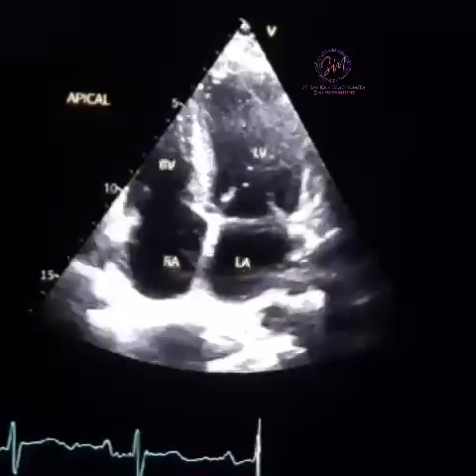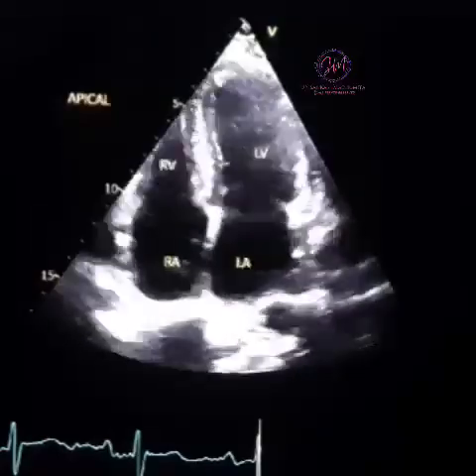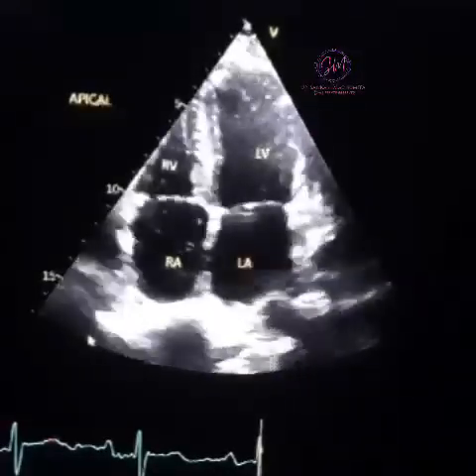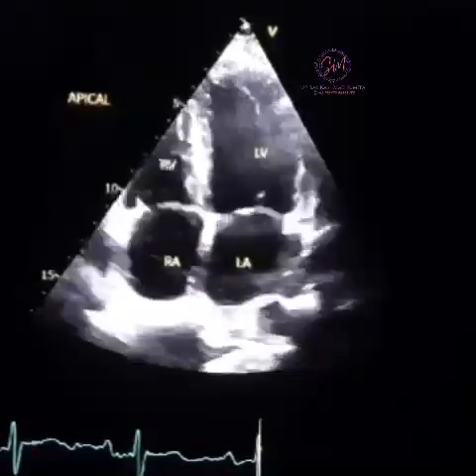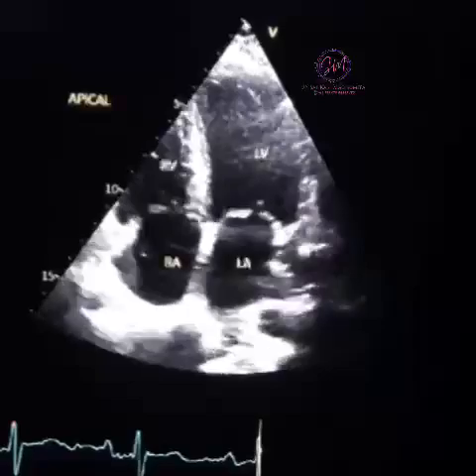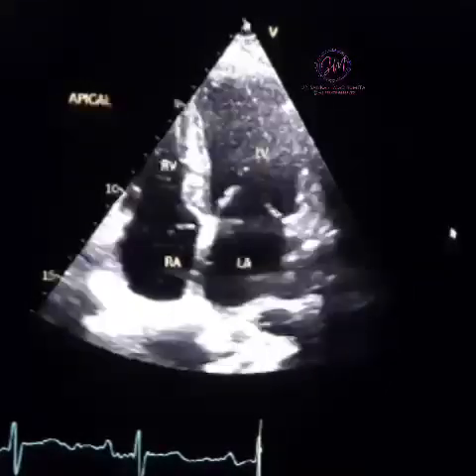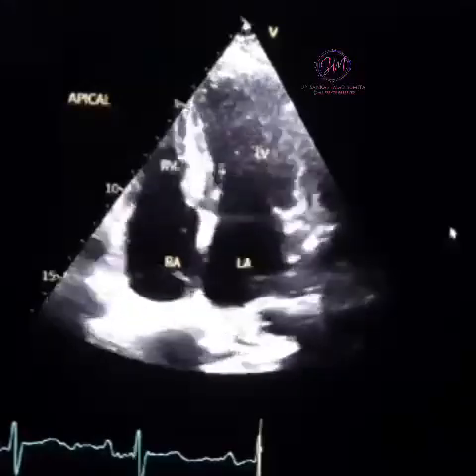We must exclude atrial septal defect, which is a common association with persistent left superior vena cava, by looking at the contrast study as well. Like in this case, you can see the contrast is present on the right side, but there is no contrast coming to the left side, which could have occurred due to an atrial septal defect. So this is only persistent left superior vena cava, but no atrial septal defect associated with it.